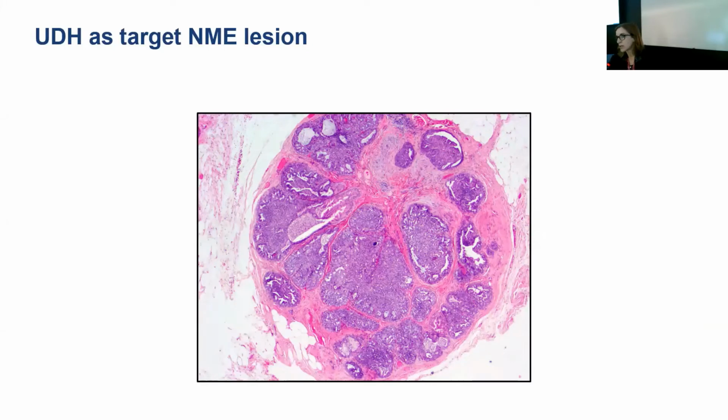UDH, we don't tend to think of as a mass-forming lesion or an image-detected lesion, but you can see here this tiny little, probably 2 or 3 millimeter nodule.